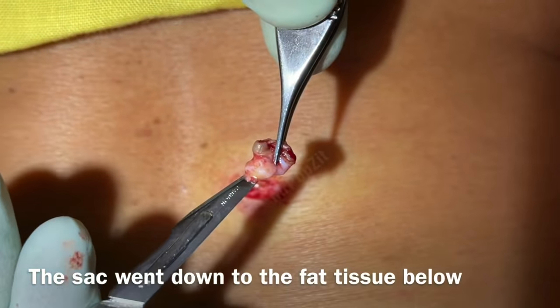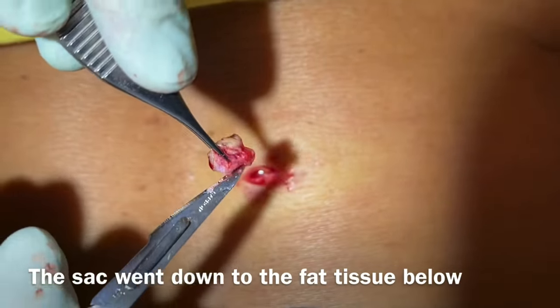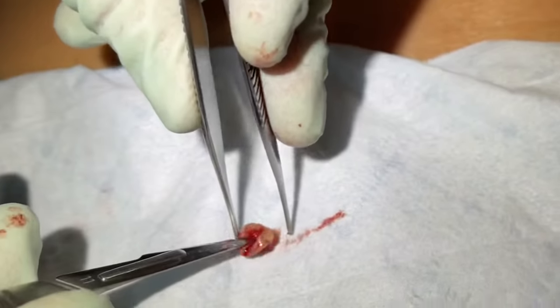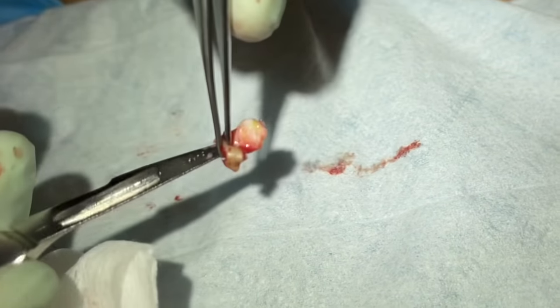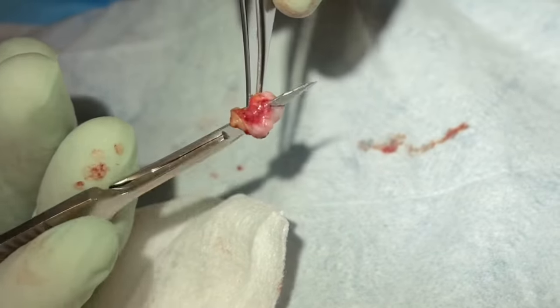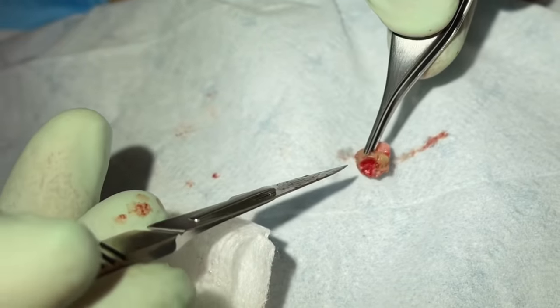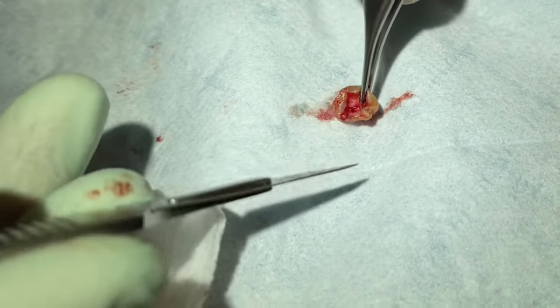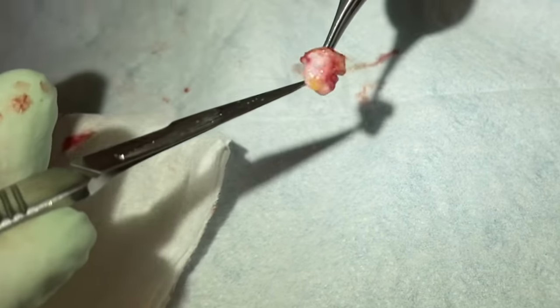That's the bottom of the sack — you can see it goes down almost a centimeter. We open that pocket up. You could poke right through the bottom there. That was the whole cyst sack right here, just under eight millimeters, punched out perfectly. Looks like a little coin purse — we'll call it the coin purse blackhead.